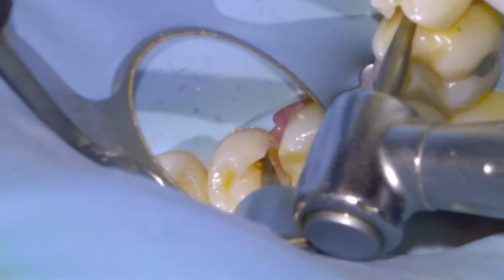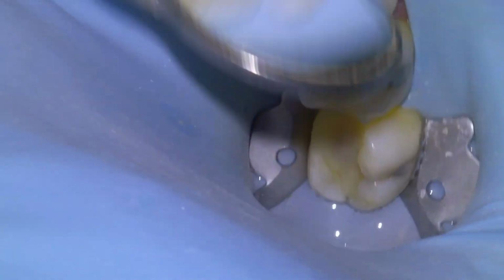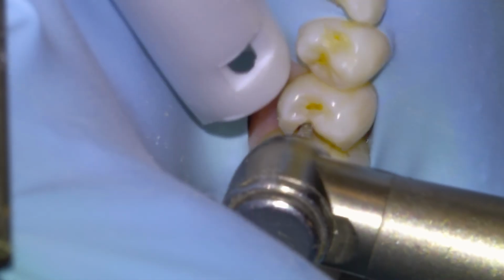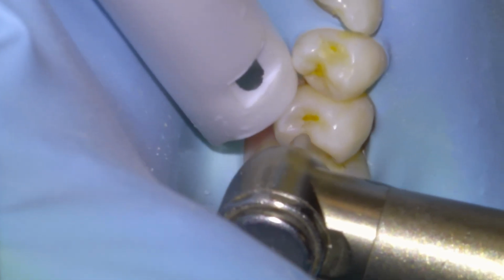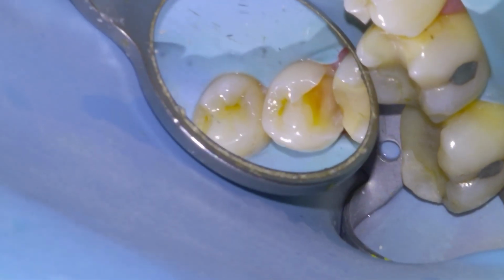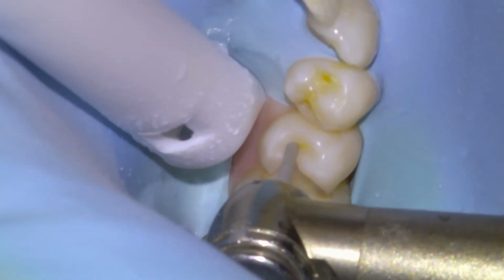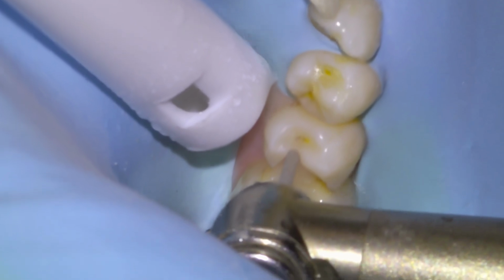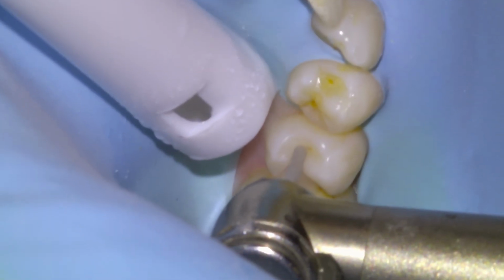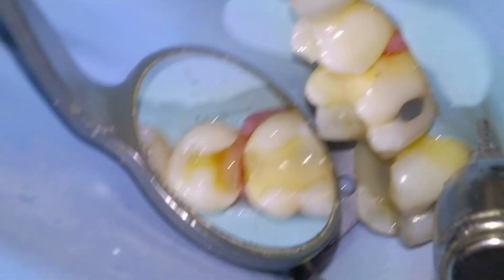So we're going to go in with our small round carbide. And still a ways to go. So we'll continue with our KS1 burr. And we're getting close. The DEJ is looking better, but still a ways to go. I like to make retentive grooves, dovetails into the occlusal surfaces of class 2s.